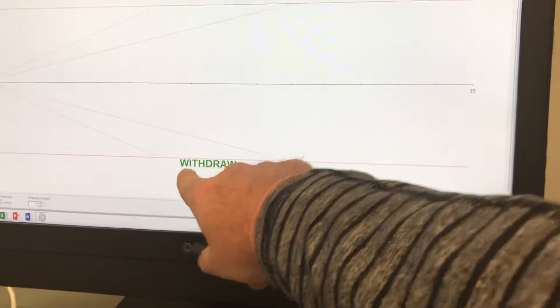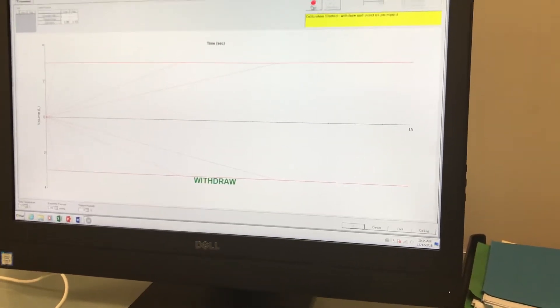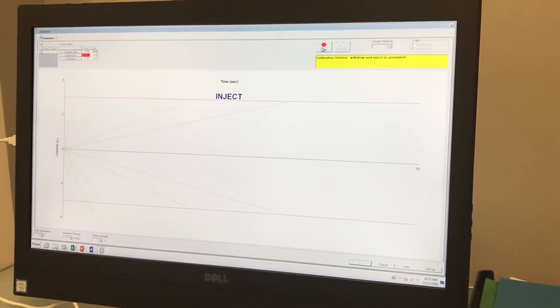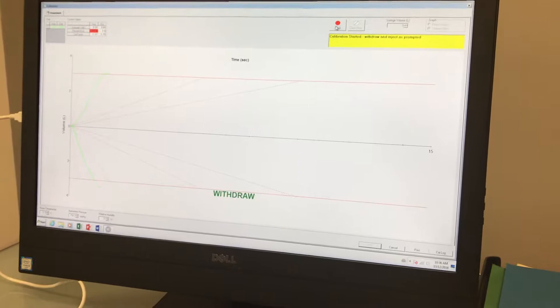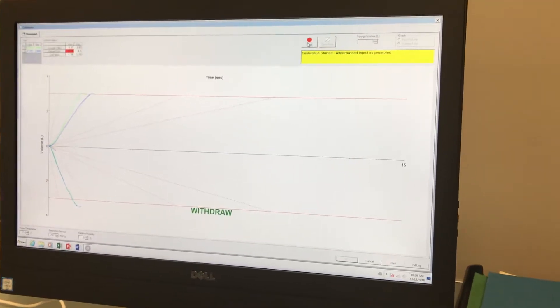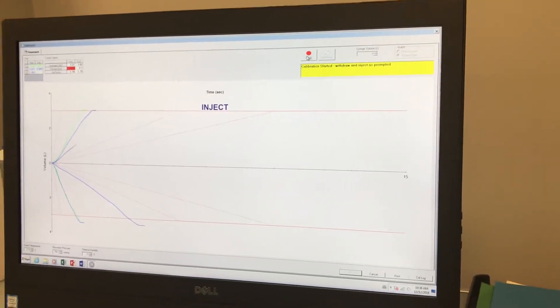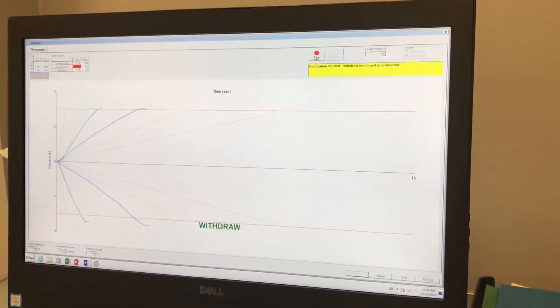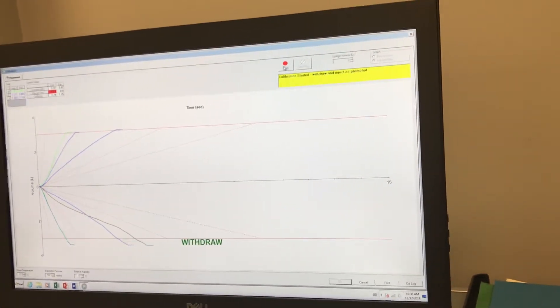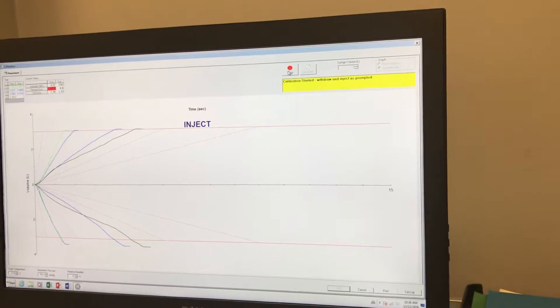You'll see that it is asking me to withdraw right now. Just wait until you see the word 'inject' before you start to inject after the first withdrawal. You can see that I am a little bit outside the calibration on the withdrawal, which is good, because that will help us know what to do the next time.